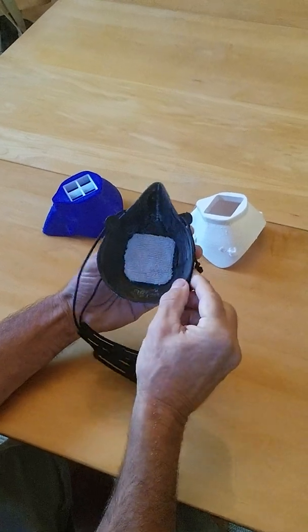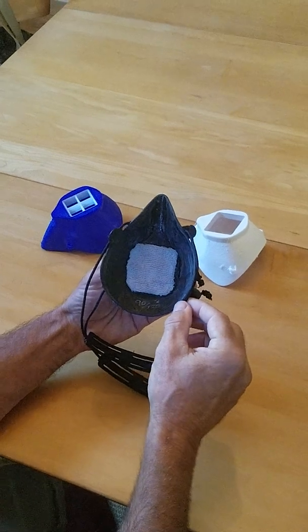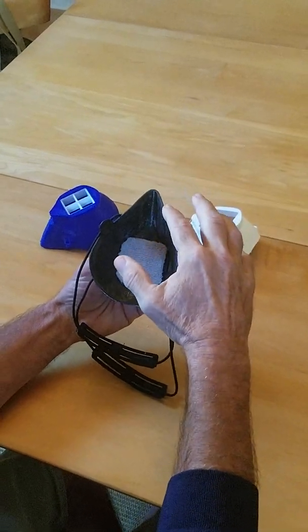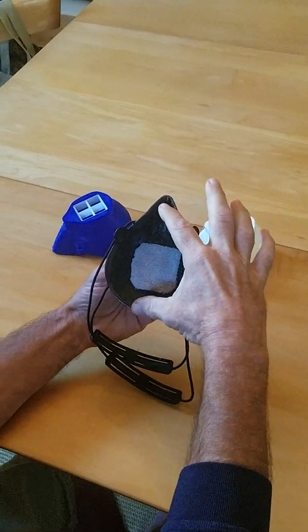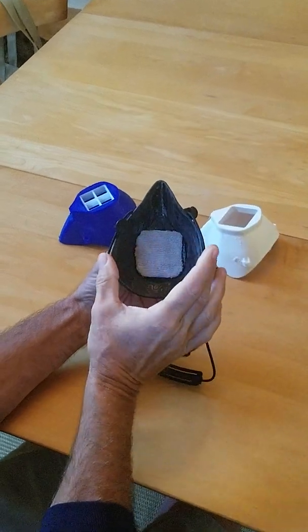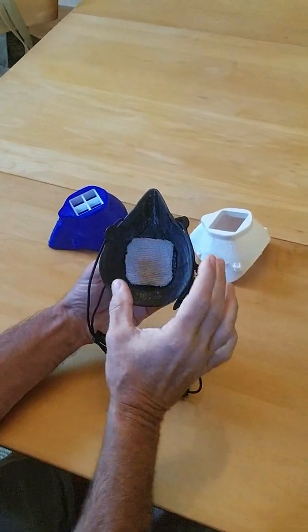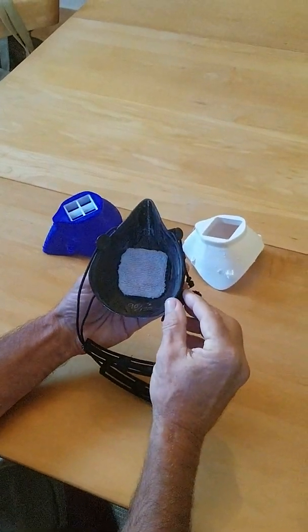But when you try this on and give us feedback for your refitted mask, you can tell us that it rides up on your nose, for instance, too much, or that it's way too long, or just about right but a little bit too long, or maybe a little too short. So really the descriptions you'll be giving me are that it's really too much, or it's almost there, or something like that. You don't have to talk in percentages by any means. In fact, we ask that you don't.